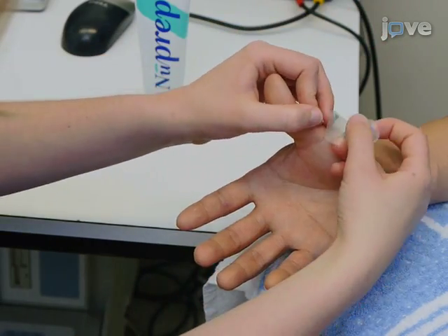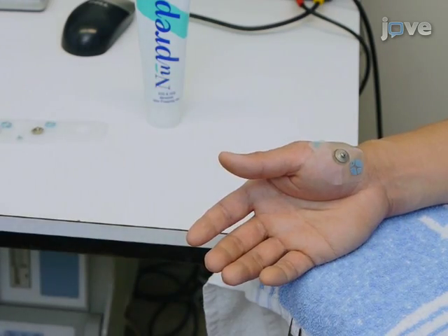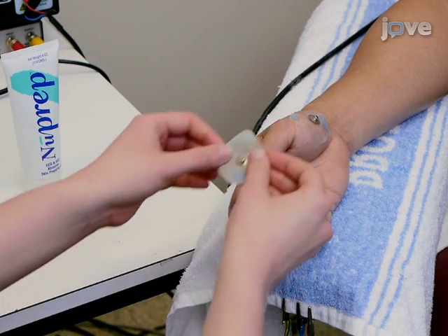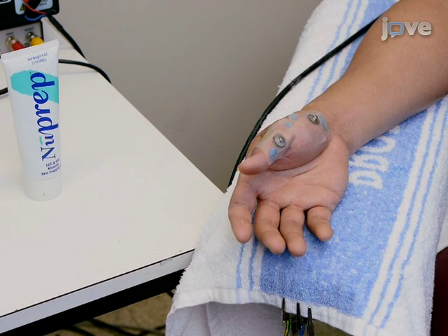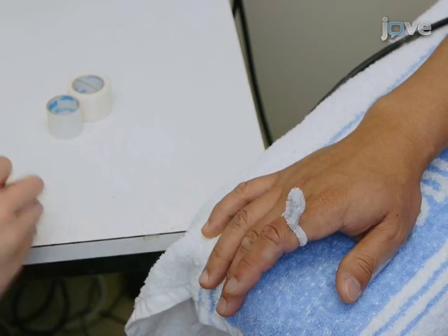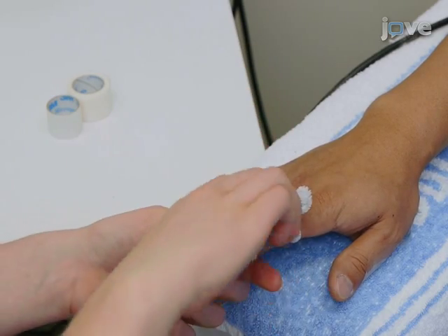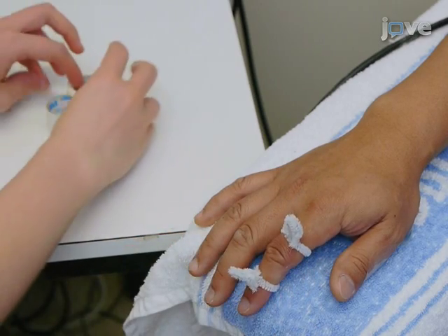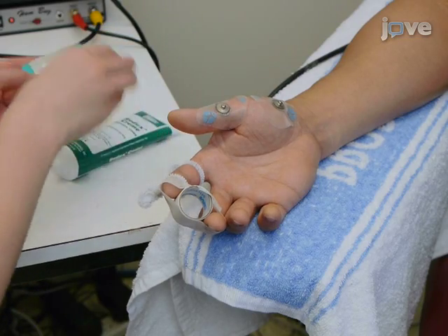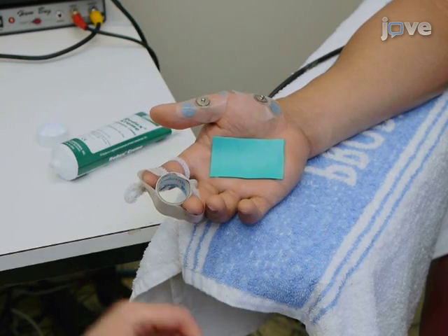Next, prepare the recording site for motor recordings by placing non-polarizable electrodes on the muscle belly of the abductor pollicis brevis. Also, place a reference electrode 4 cm distal to this location to record compound motor action potentials. Now prepare the recording site for sensory recordings using ring electrodes placed at the proximal and distal interphalangeal joints as active and reference electrodes respectively to record compound sensory action potentials. Also place an electrosurgical neutral earth plate in the palm with conductive gel and tape the fingers to stabilize them.